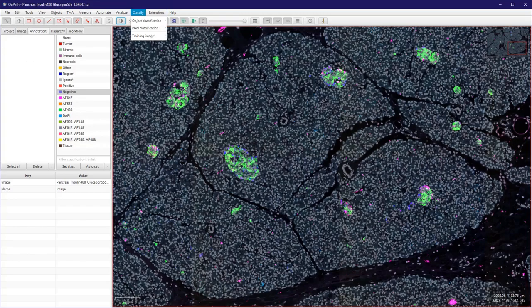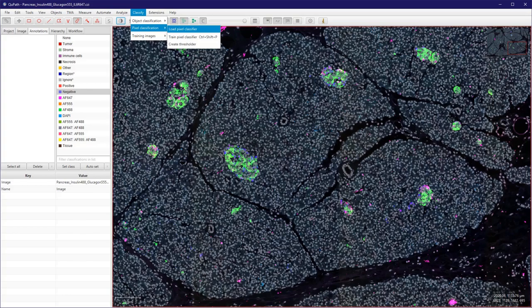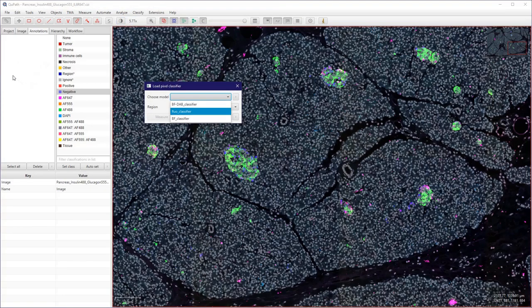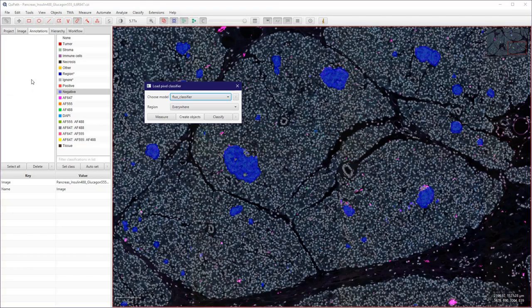And to do that I used a pixel classifier which is actually just a threshold here. I will just load this pixel classifier which I saved as a fluo classifier here, and from that I created the objects by using the create object command here from the full image.